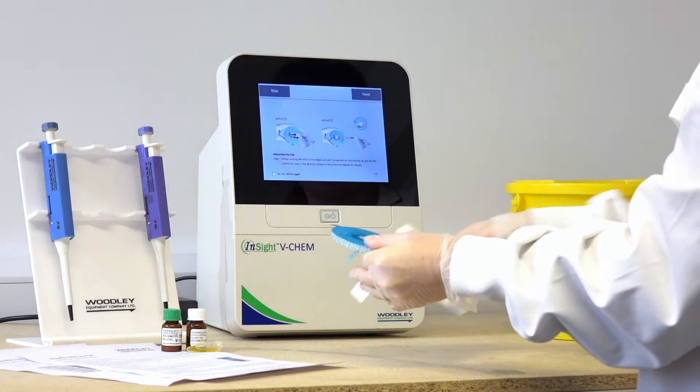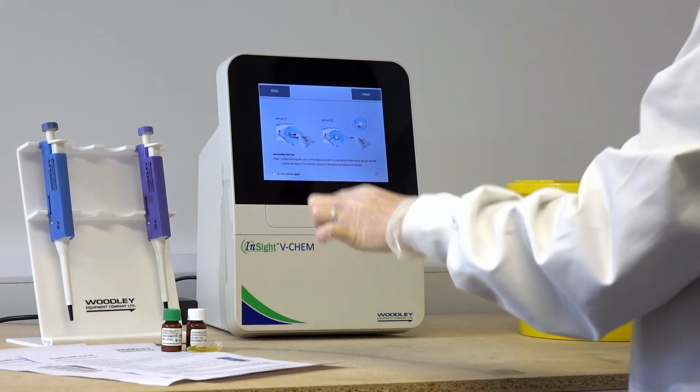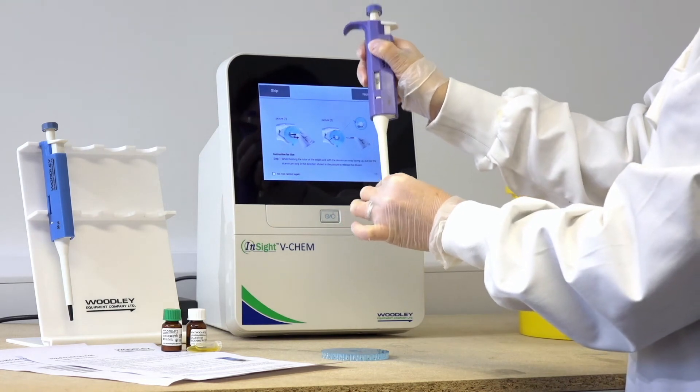The QC is pipetted the same as a patient sample into the rotor, and the foil tab is removed.